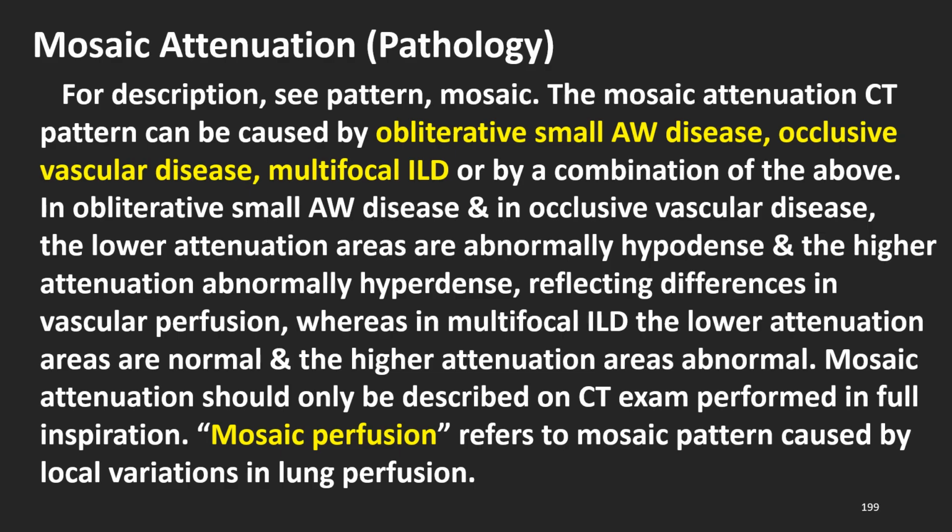Mosaic attenuation pathology. For description, see pattern mosaic. The mosaic attenuation CT pattern can be caused by obliterative small airway disease, occlusive vascular disease, multifocal interstitial lung disease, or by a combination of the above.